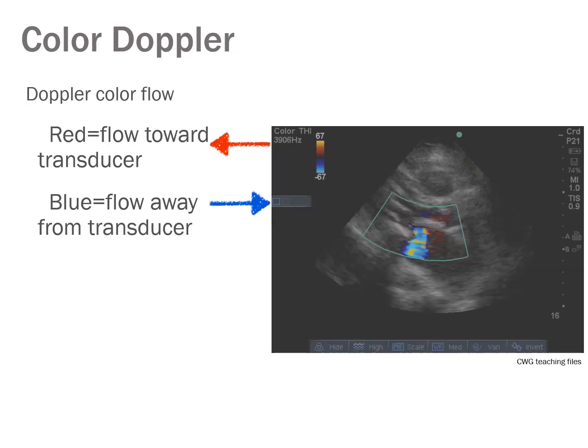Now let's talk a little bit about Doppler. We talked about the idea that an ultrasound probe chirps out sound and then listens 99% of the time. But when you're talking about Doppler, it has a 100% duty cycle, meaning it's always talking. Therefore, when you put Doppler on, you're putting more energy into the tissues and you're doing more talking and less listening. Therefore, the resolution goes down.